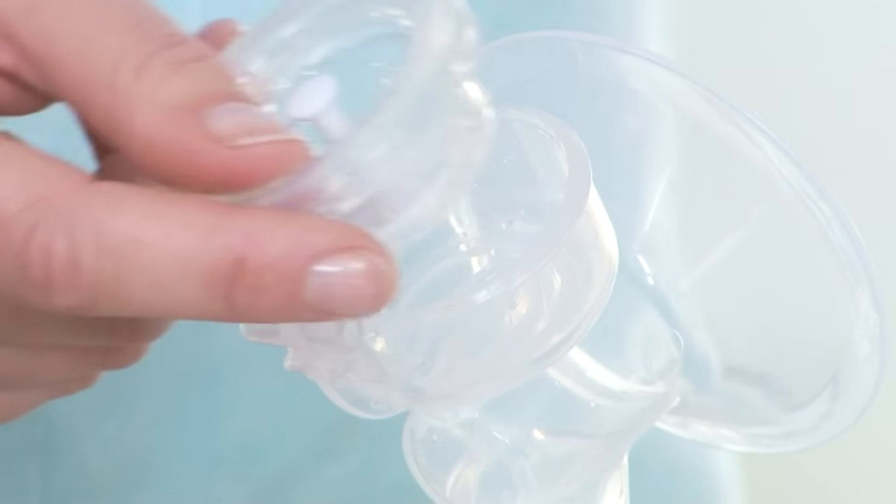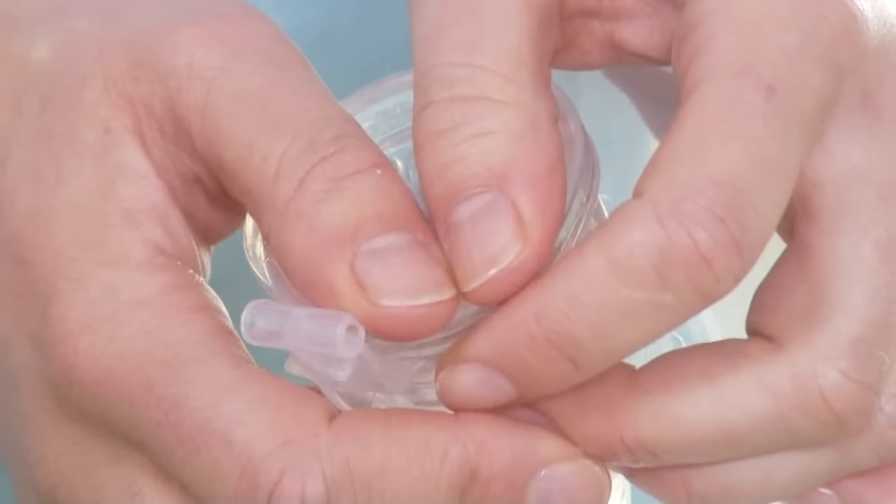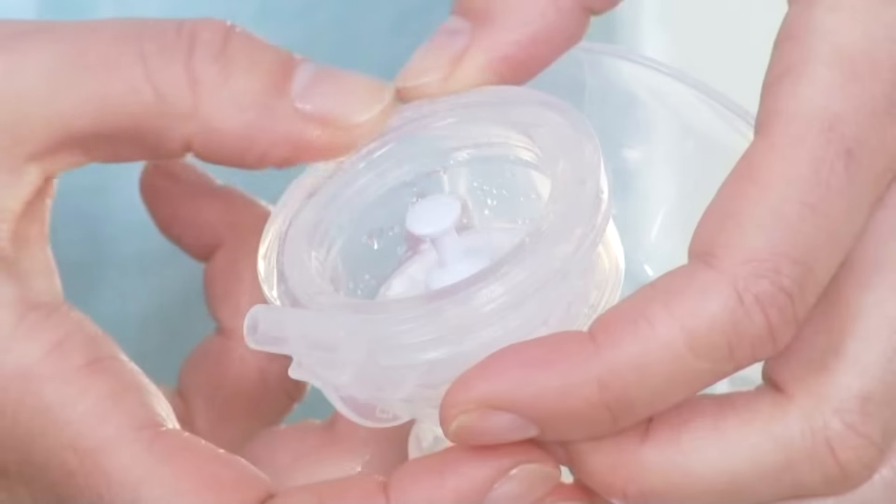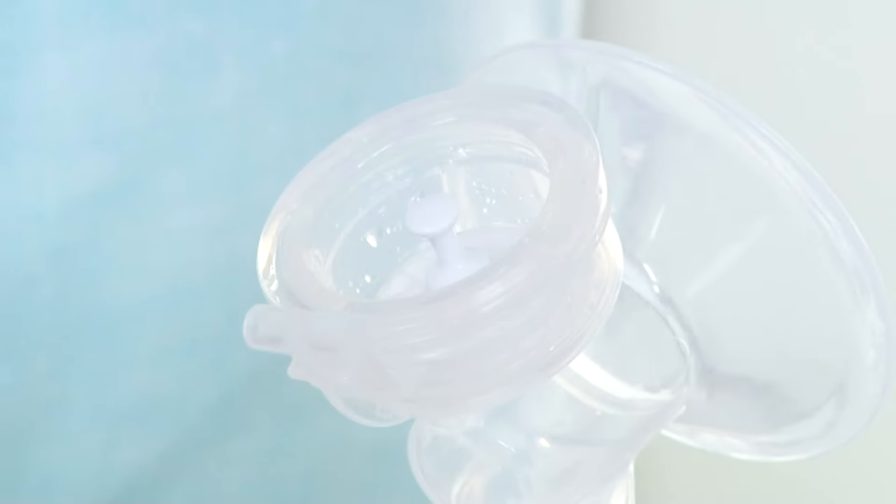Place the silicone diaphragm with stem into the pump body from above. Make sure it fits securely around the rim by pressing down with your fingers to ensure a perfect seal.